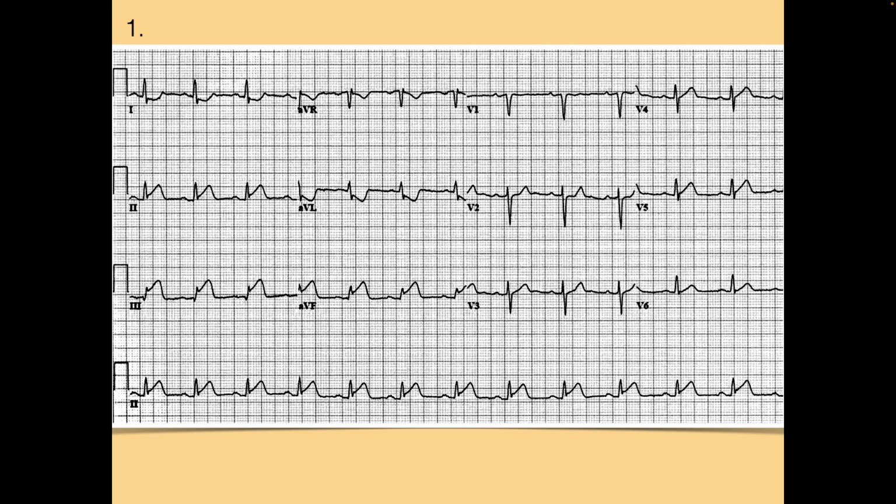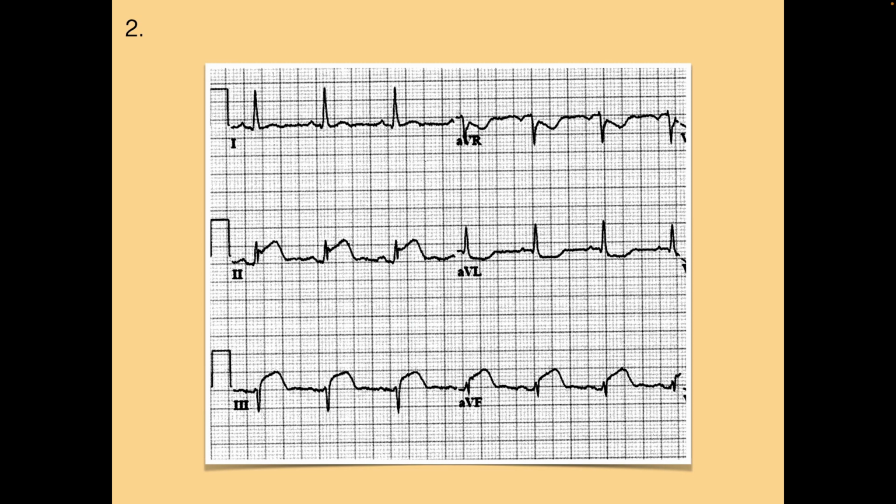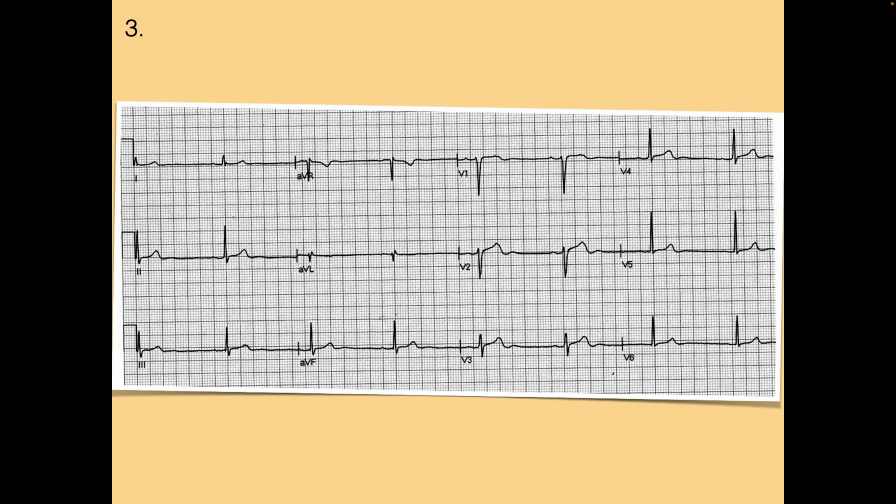I'm going to show you plenty of examples of how things can change. So if you have ST elevation you're not sure of, check in 10 minutes, see if it's changed. But this one's pretty clear because of 3 and AVF. And then 2 we also talked about, so we have 3 good leads of ST elevation. Everybody see it? Okay, Natalie, what about number 3? I did not see any. Nope, no ST elevation here, so no inferior STEMI here. Everybody okay with that?